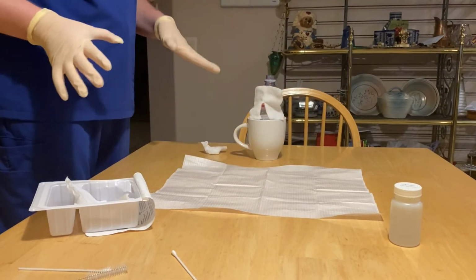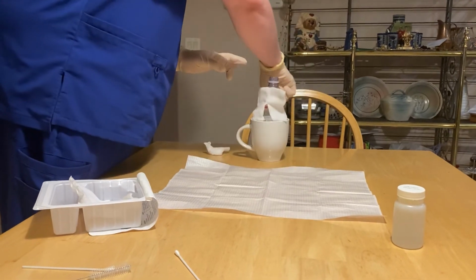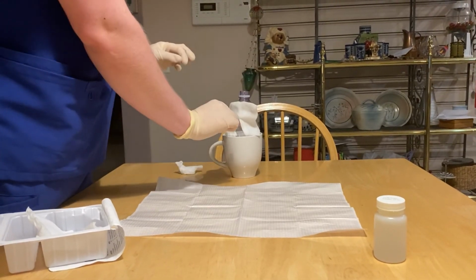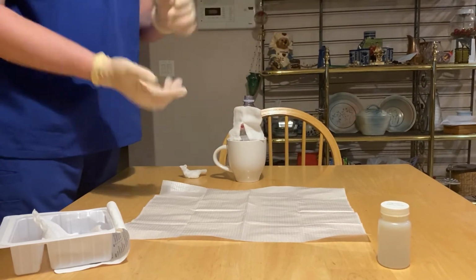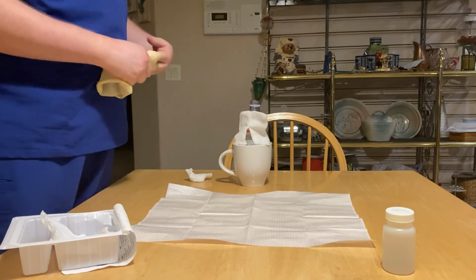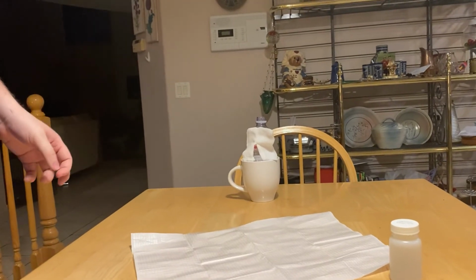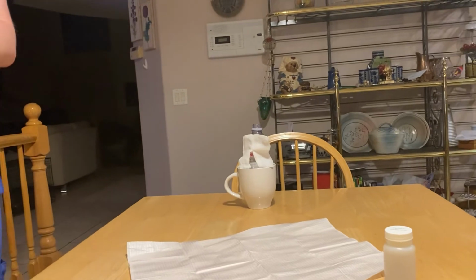So there, and then if I was replacing straps, I would first put one strap and take it all the way around, and the new one I would put it on one side, take it all the way around, clip it, and then after I've secured the new one, I would then take the old one off, and then deglove, and throw everything away according to policy. And then after I've discarded everything, hand hygiene, thank the patient.